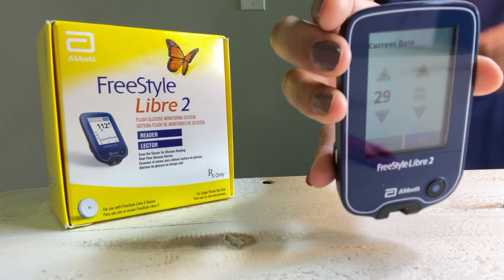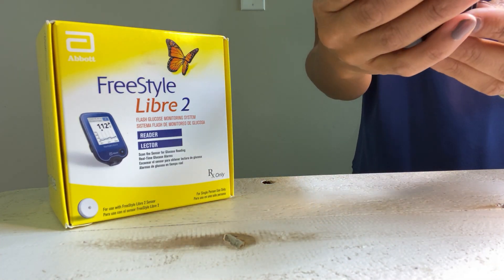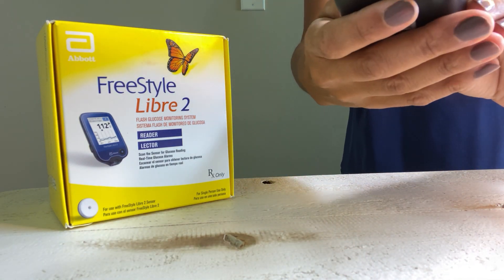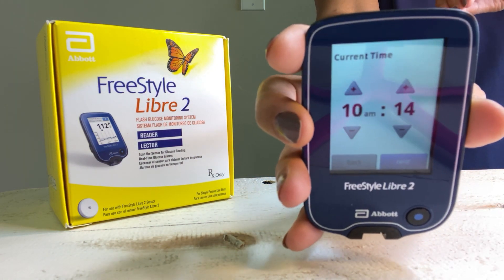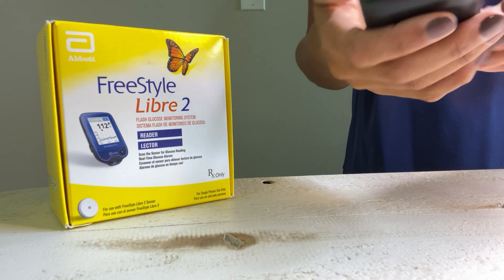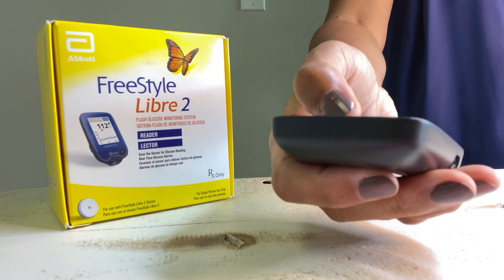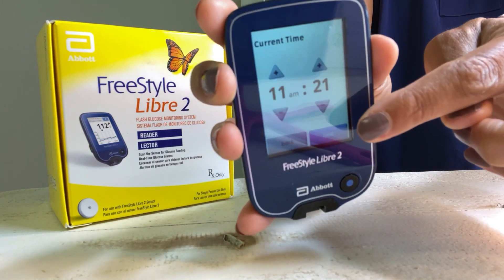Next, it asks for the date. Today is July 29th — it got it right. I just click next. Then it asks what time it is, and it got that right as well. It's 11 p.m. here in California. You simply use the touchscreen to adjust. Once the time is set, you click next.